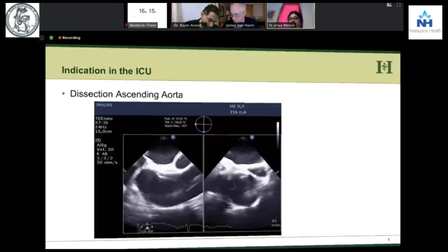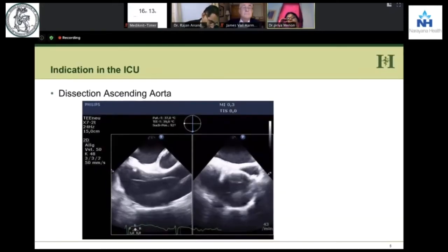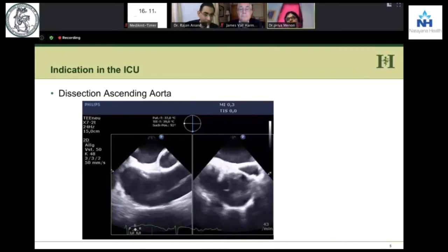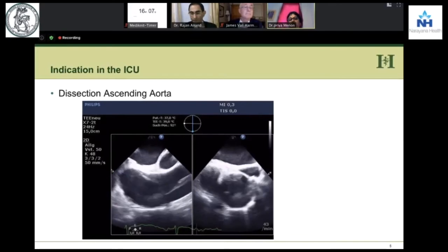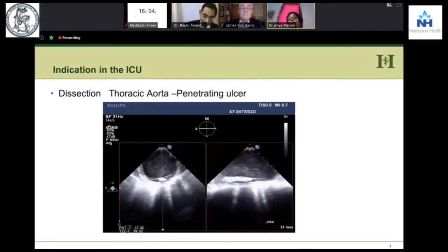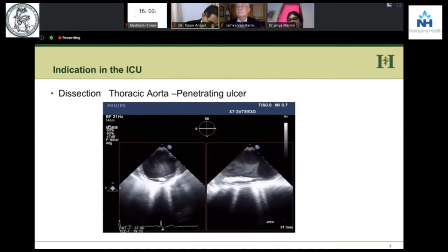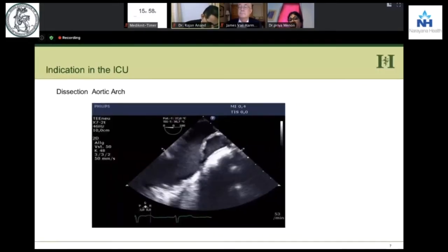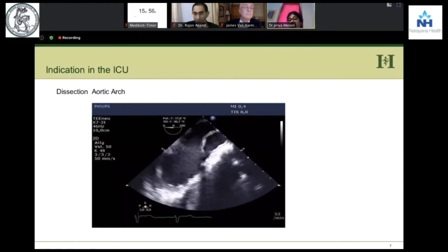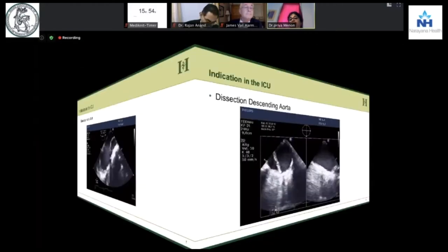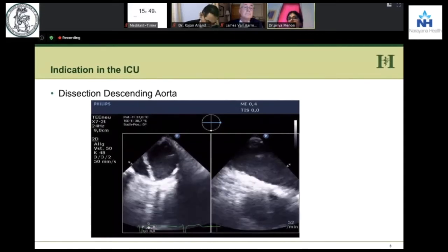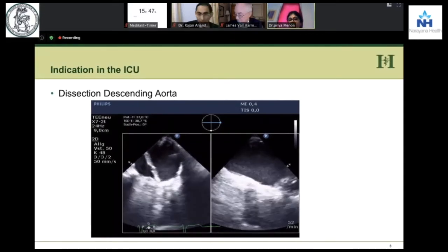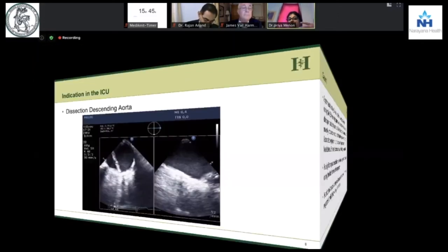Let's start one by one. Here you can see — I think by now you know what dissection is. This is ascending aorta dissection. Dissection in the thoracic aorta because of a penetrating ulcer. Dissection in the aortic arch and dissection of the descending aorta. These pictures are so easy to obtain, and we get a direct diagnosis — you don't need to do more.